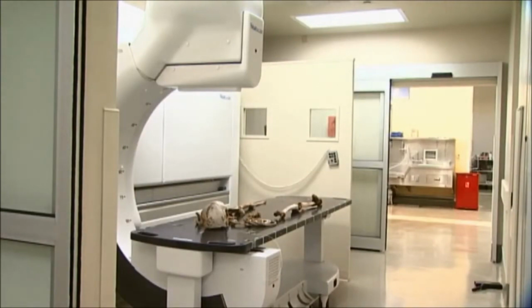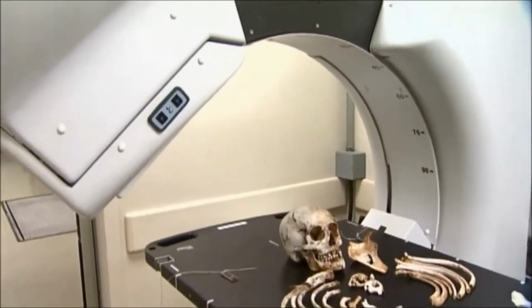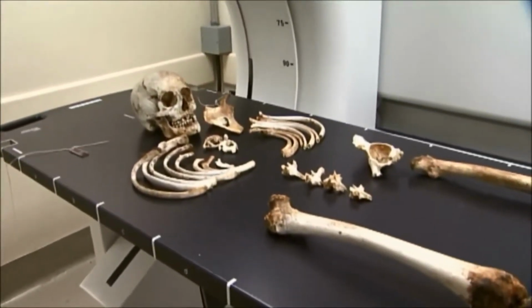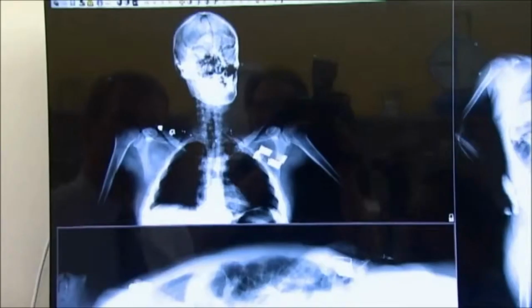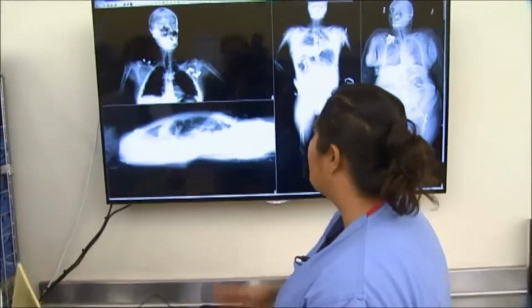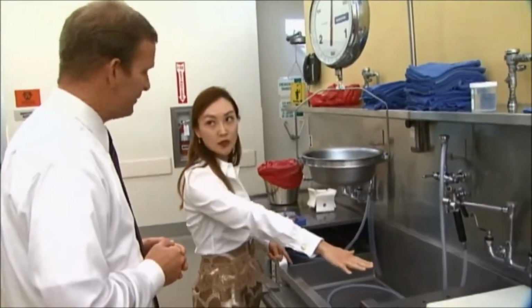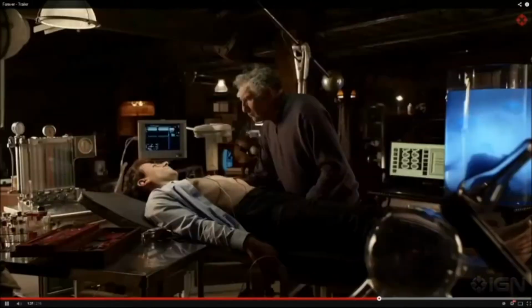Riverside County is just one of less than a handful of agencies nationwide using this Lodox. Another plus, its scans produce 10 times less harmful radiation, a real positive for employees like technician Ivy Zandival. Coincidentally, the county's chief forensic pathologist, Dr. Jennifer Park, she's a huge fan of Dr. Henry Morgan and Forever for its realism despite the obvious fantasy.